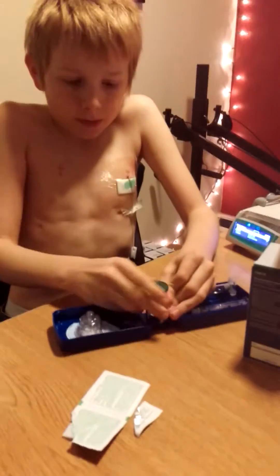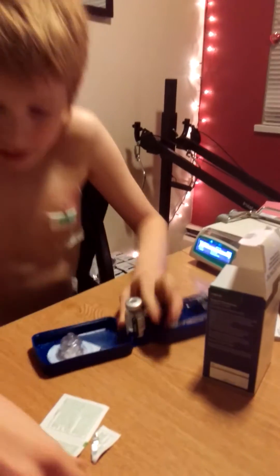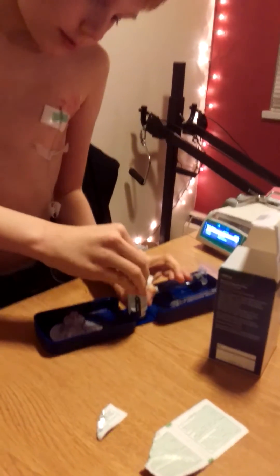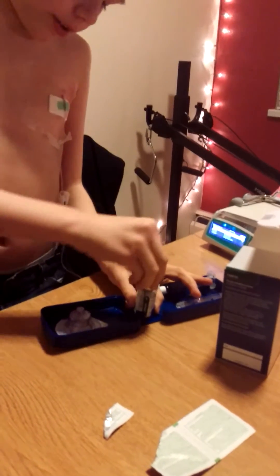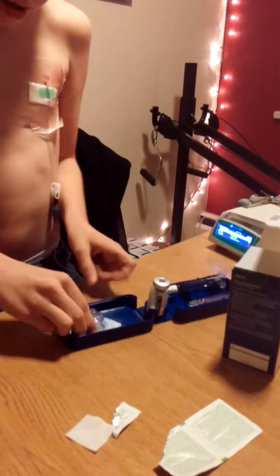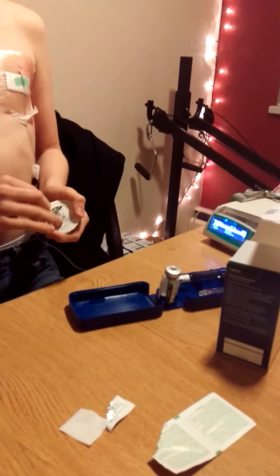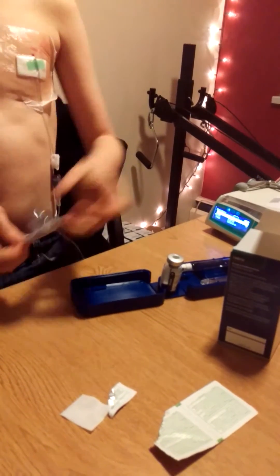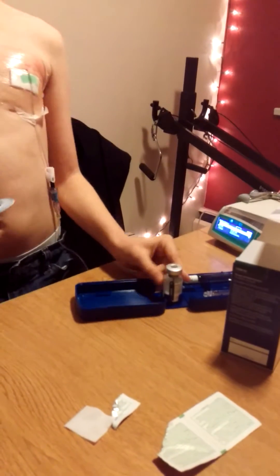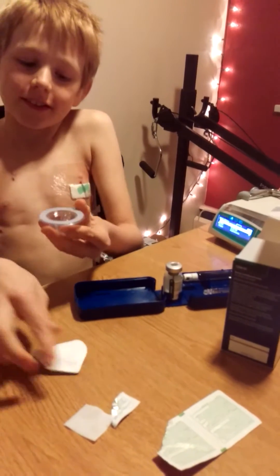On the FIBA you just pop it off like that, and then clean it with one of these alcohol swabs. Have it so it stays in there, let it dry and slide this out. This is the connector piece you put on top of it.